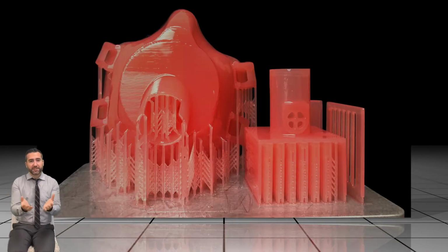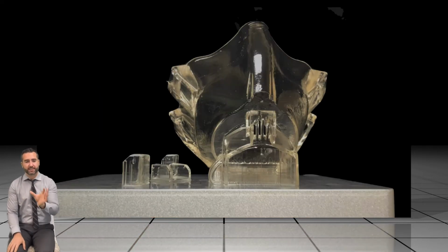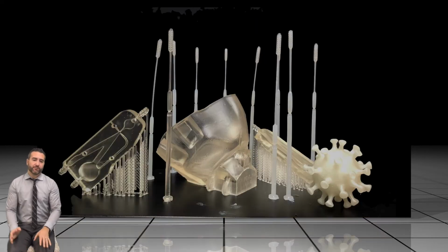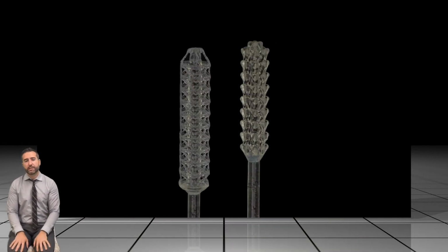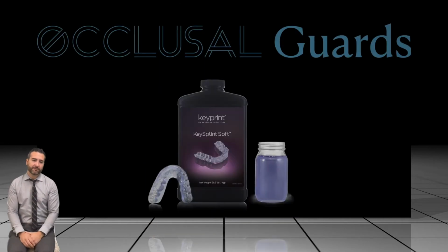And what's really cool is that during COVID, we kind of switched gears and went from printing dentures and things like that to printing respirators for people all around the world. And we did nasal swabs when there was a shortage of nasal swabs. We did respirators, all sorts of really cool things using our very cool printers that we have in the dental world. And here's one of my designs, a respirator that snaps in a HEPA filter.